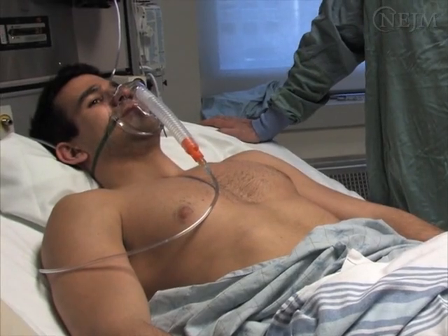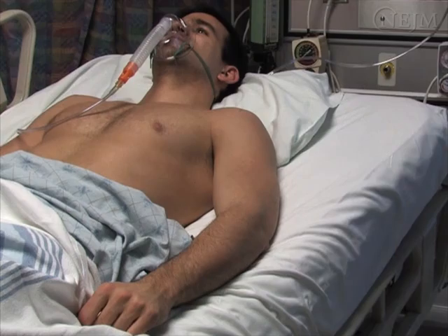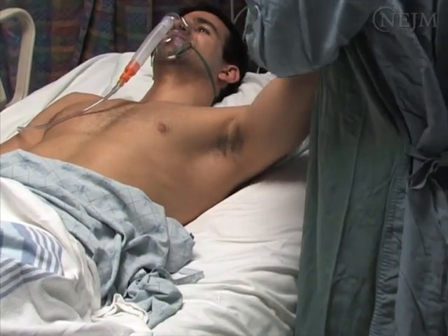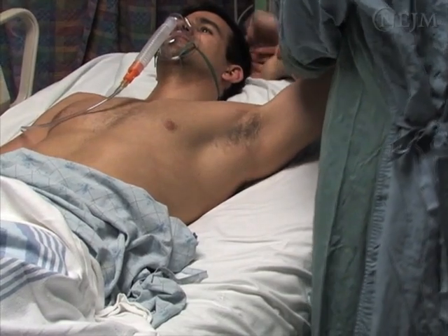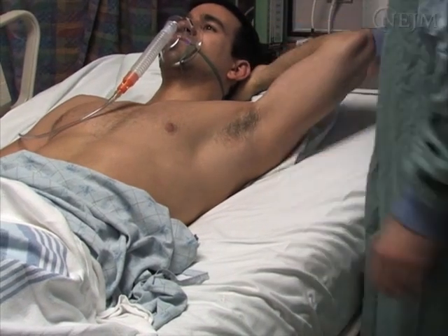The patient should be positioned either supine or in the semi-recumbent position. The ipsilateral arm may be maximally abducted to the side of the patient or, alternatively, positioned behind the patient's head in order to have optimal exposure of the insertion site.